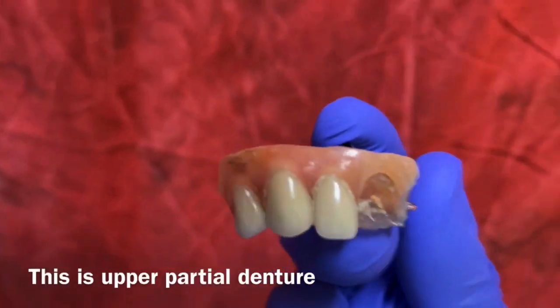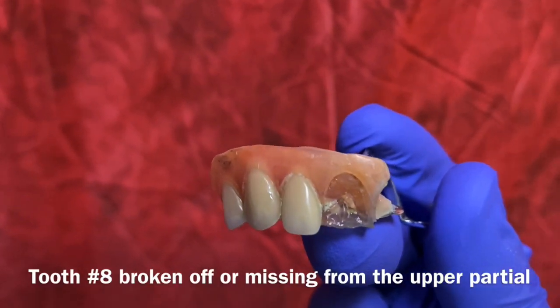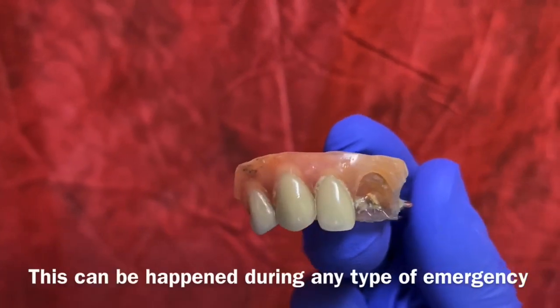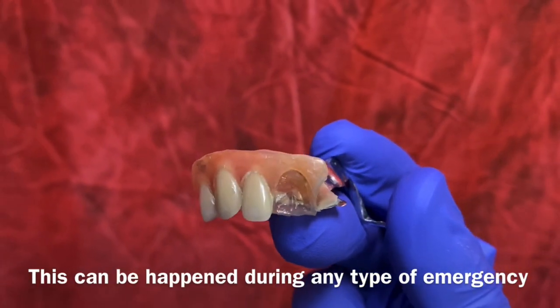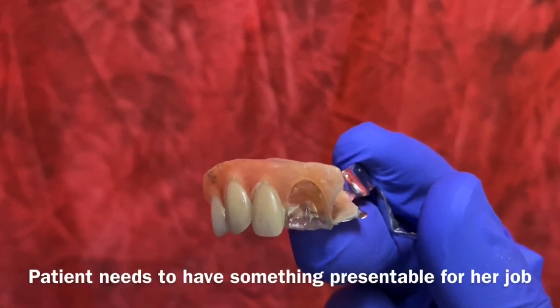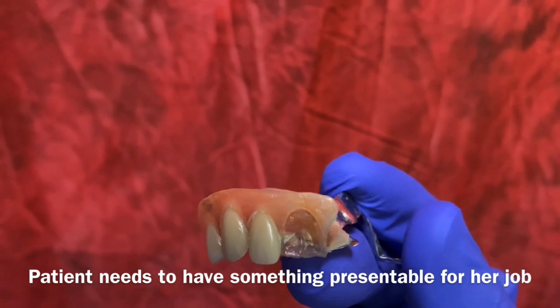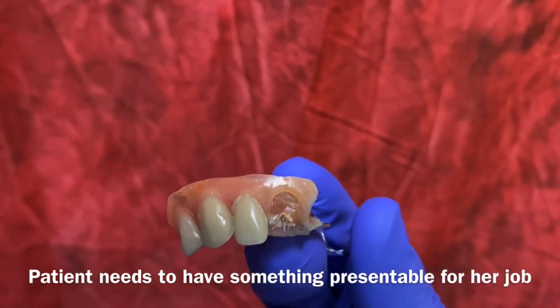This is an upper partial denture. Tooth number eight is missing. This is happening during the COVID-19 pandemic crisis and the patient needs to have something presentable to keep going, at least for her job.